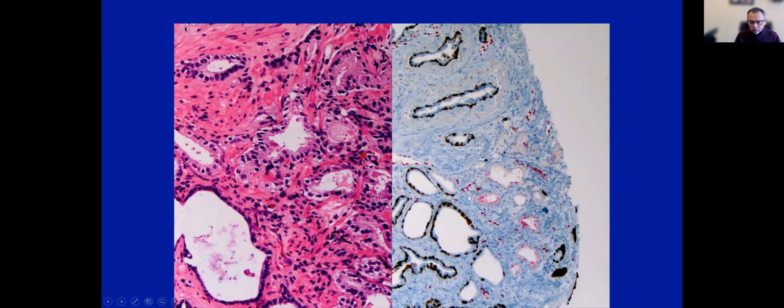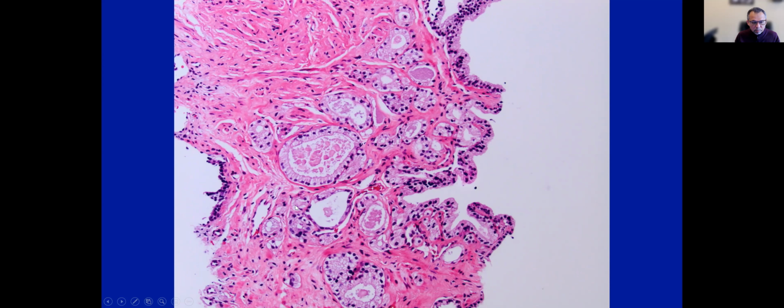So an example like this would be atypical, because you could not exclude cancer because it may still represent adenosis. In this particular example, you see proliferation of small caliber to medium caliber glands with very pale cytoplasm. Note that the cytoplasm of these glands adjacent to reference benign gland is pretty much similar, but there is a little infiltrative looking architecture type of appearance.